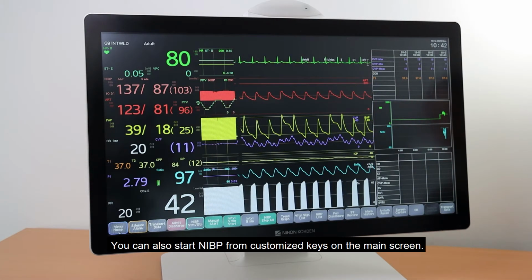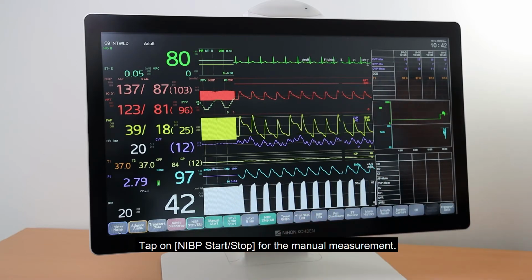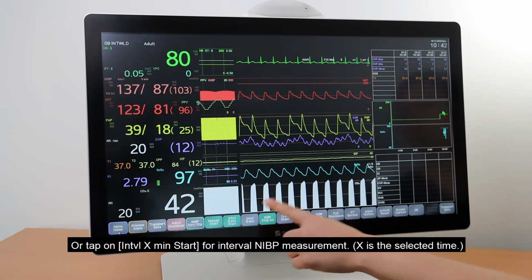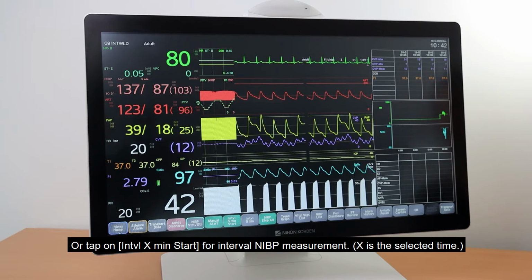You can also start NIBP from customized keys on the main screen. Tap on NIBP Start Stop for the manual measurement, or tap on Interval X Minutes Start for interval NIBP measurement.